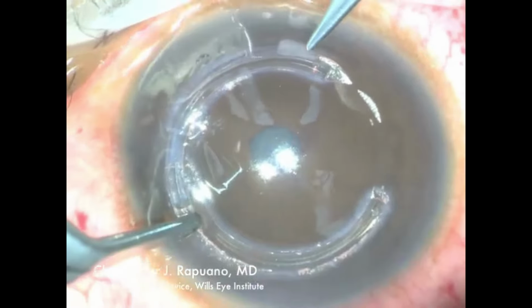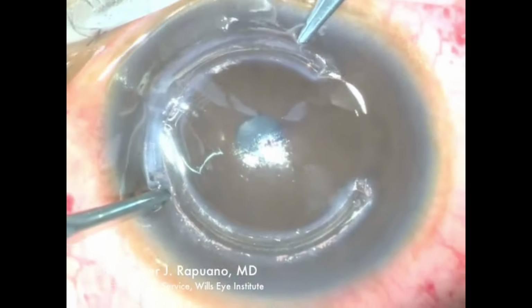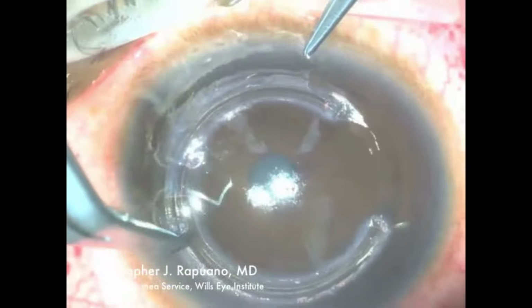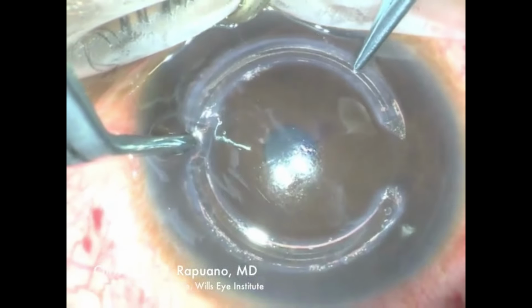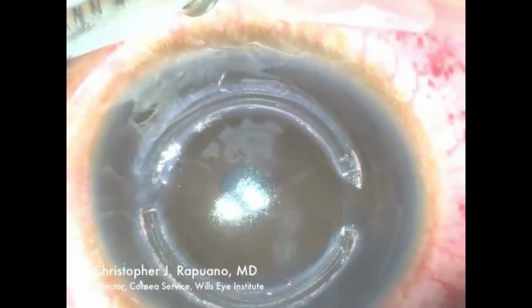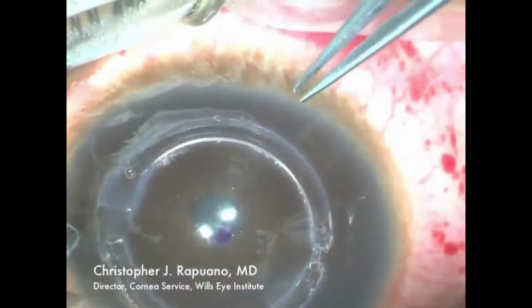Here it's moving nicely into the channel, and the second instrument is again being used to give a little bit of pressure to move it around the semicircular stromal incision that was made by the femtosecond laser. There the Intacs is popping into the wound, and then it'll be pushed in a little bit further so that it doesn't sit right next to the incision.